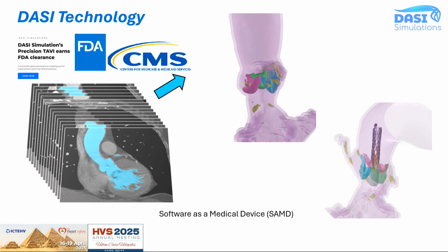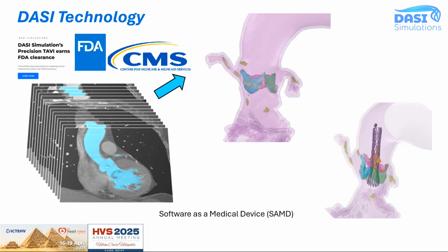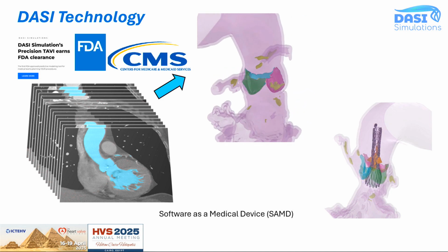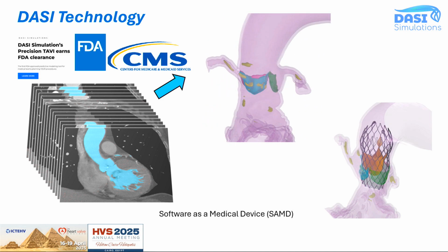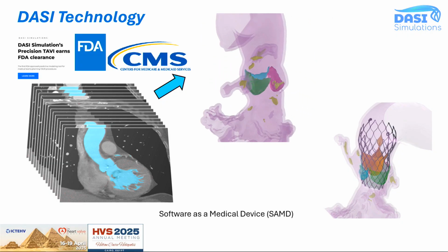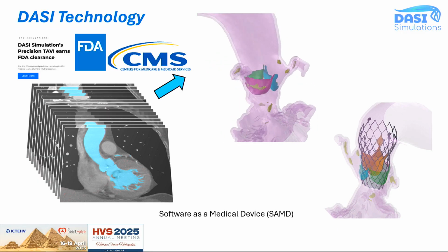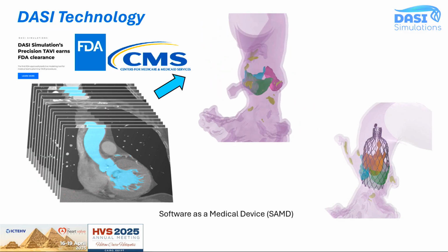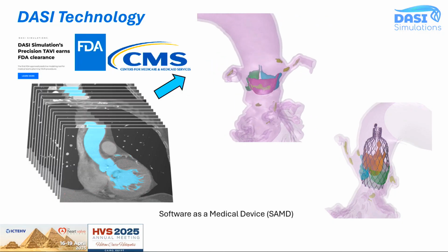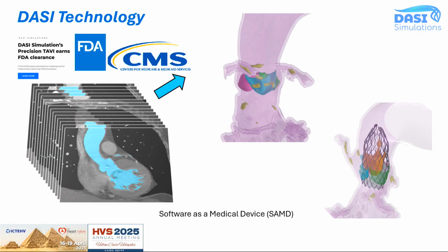So to outline the DASI technology, we begin with pre-TAVR CT scans, and as you can see here on the left, we are able to create these models via a process called segmentation. So you can see that model in the middle there. It has each of the leaflets, and we were able to model this native patient anatomy prior to the procedure and be able to simulate the deployment of, here on the right you can see, for example, a Medtronic CoreValve, or also balloon expandable options. We have a variety of valves we were able to simulate prior to the procedure.